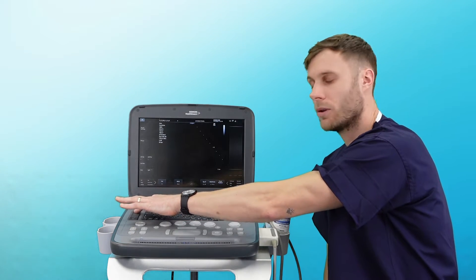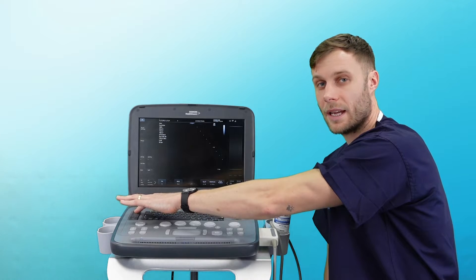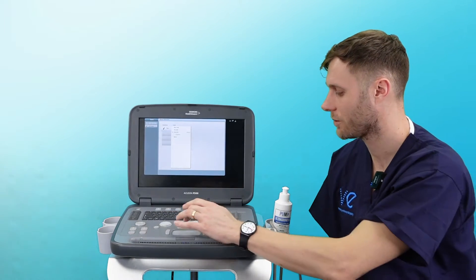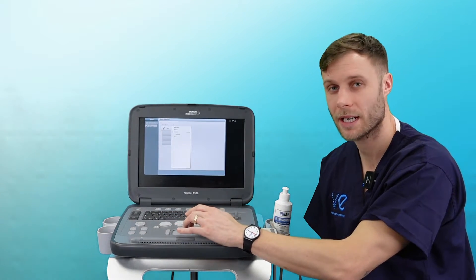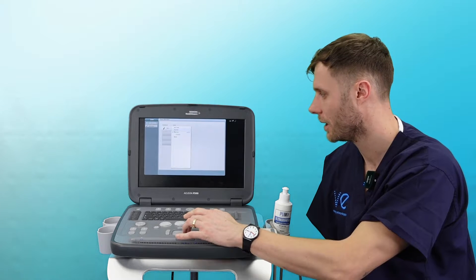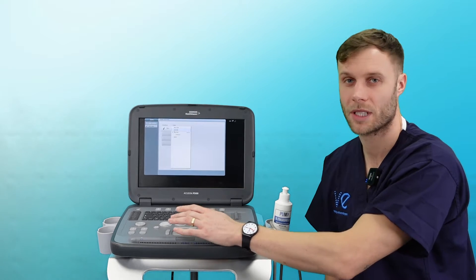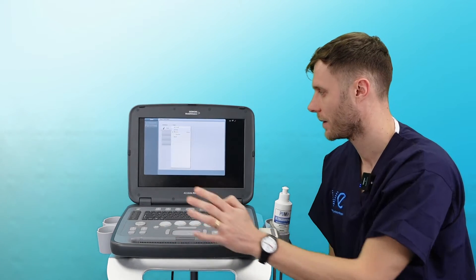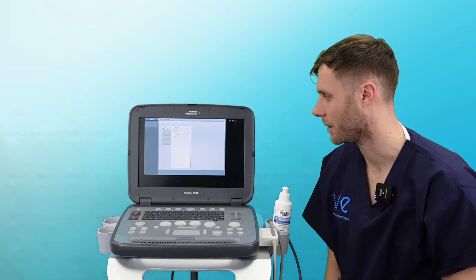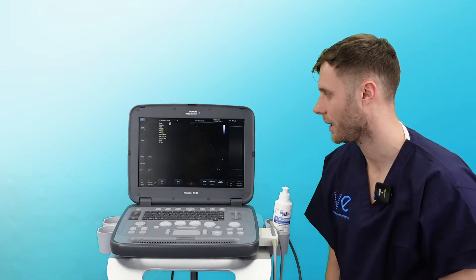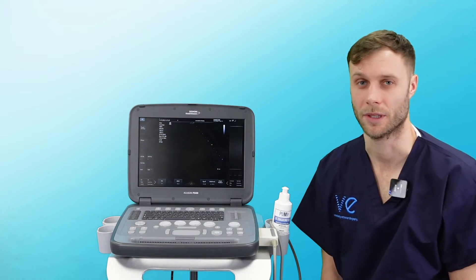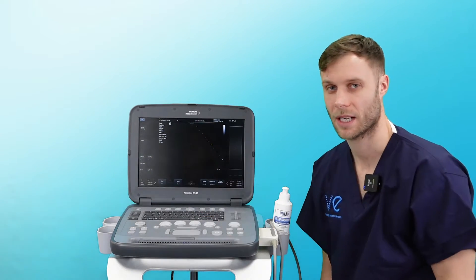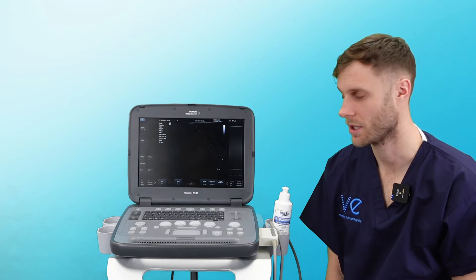Next, I would always click Exam under the patient key, and then this will bring up your presets on the probe that you've got plugged in. Just select whichever preset is most suitable for the scan you're doing. You can change the settings for what you're doing here, so it's always worth checking what exam you're in when you first start scanning.